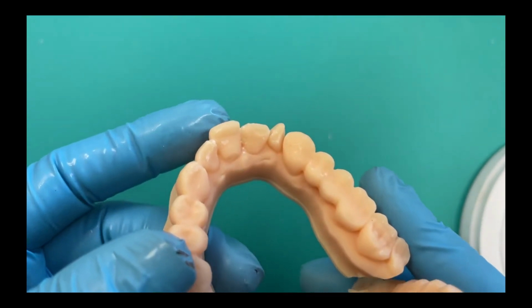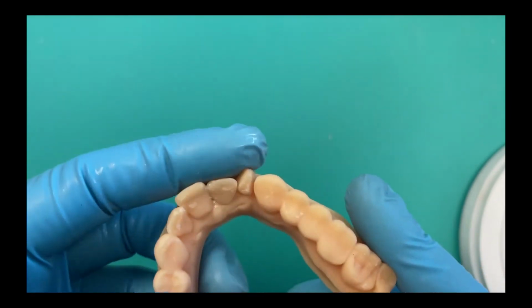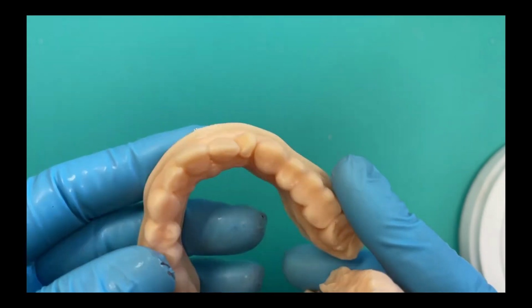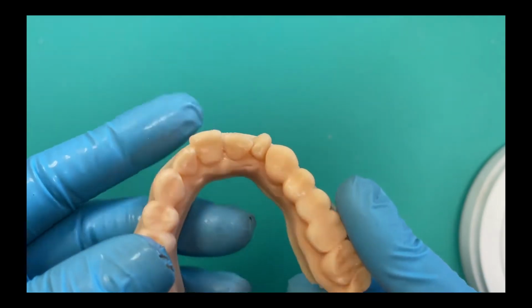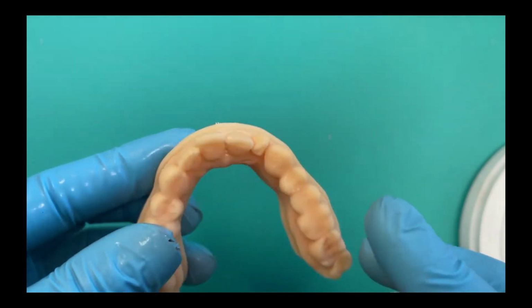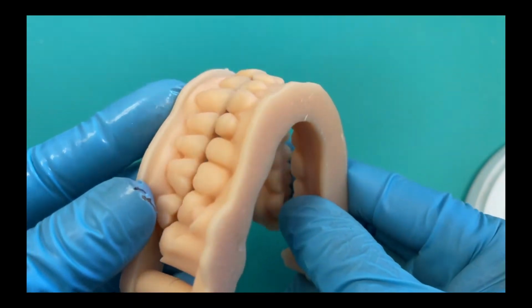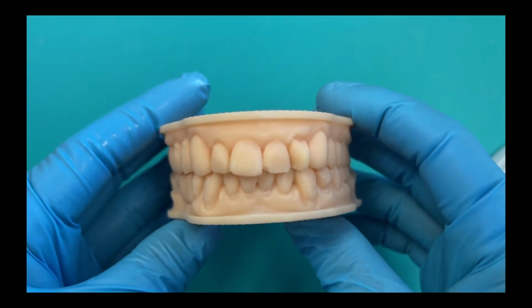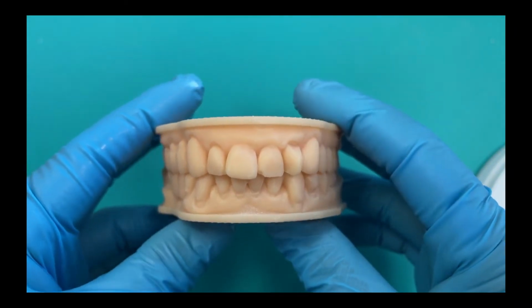So you can see tooth number 8 is a crown, because it's nice and bulky like a lot of crowns are. Tooth 9 is a natural tooth that the patient has worn down. And tooth number 10 is an unnatural tooth. Well, it's a natural tooth, but it's so far rotated. Look, it's got an abfraction lesion on the distal. You never see that before, but that's because the distal is now turned out towards the buccal.